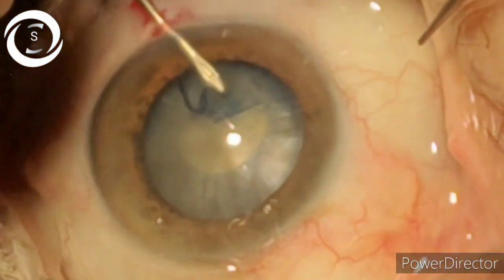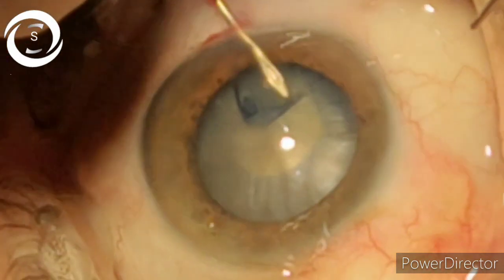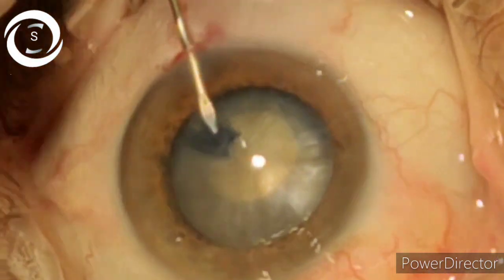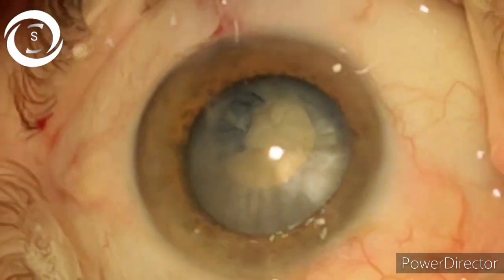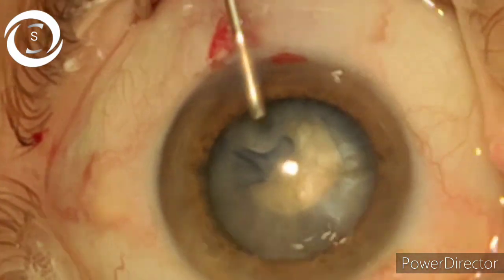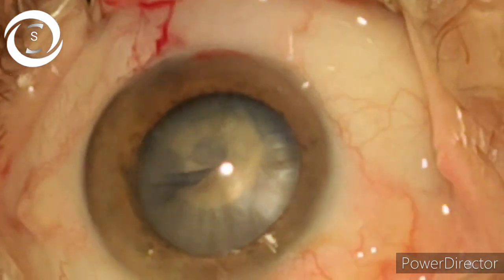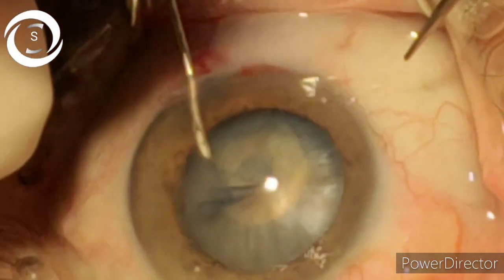This is just like a cochlear curve with an enlarging circle. You can see that I am interchanging the cystitome with capsulorhexis forceps. Whenever the anterior chamber gets shallow, I come out, put viscoelastic, and start again. It's a very gentle step that takes a lot of patience, but it is the most important rate-limiting step.